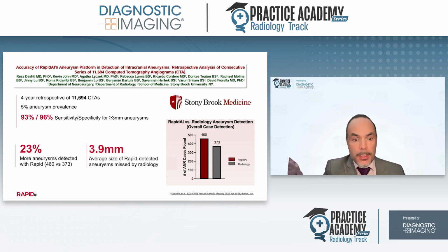In terms of the potential benefit of increasing aneurysm detection, again, for any in the audience who are unfamiliar, aneurysms can be very easy to miss. In fact, they're missed quite often. This is a nice study from our Stony Brook colleagues who were using Rapid AI.